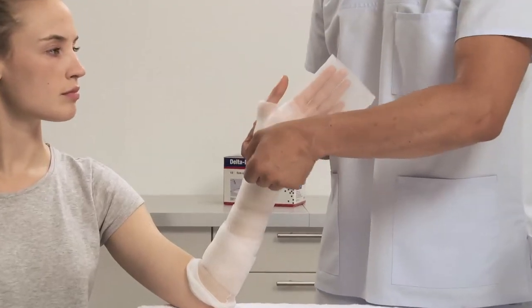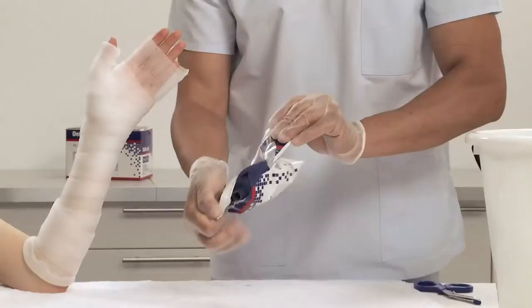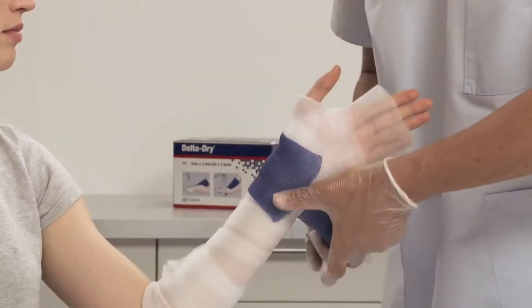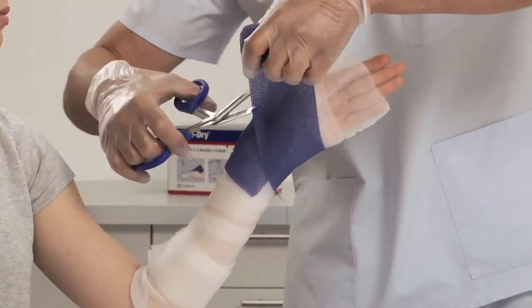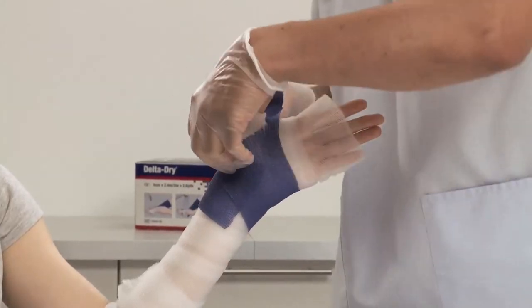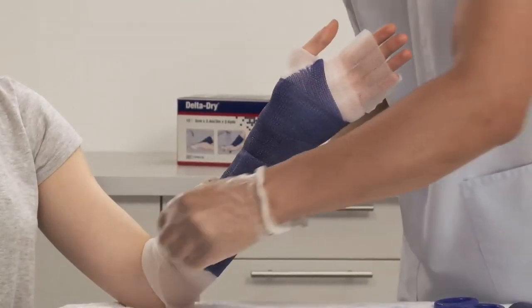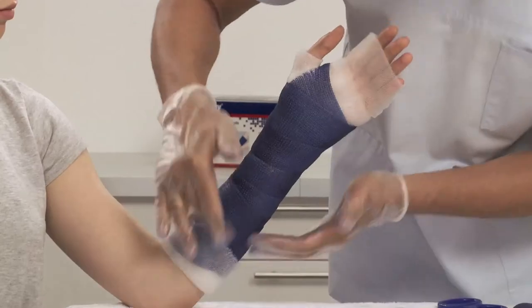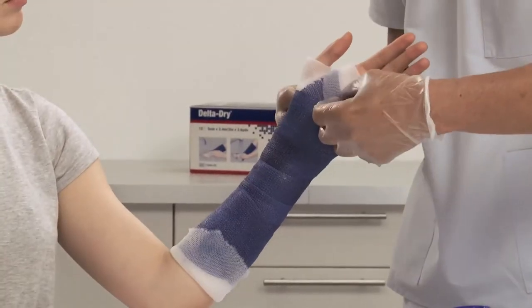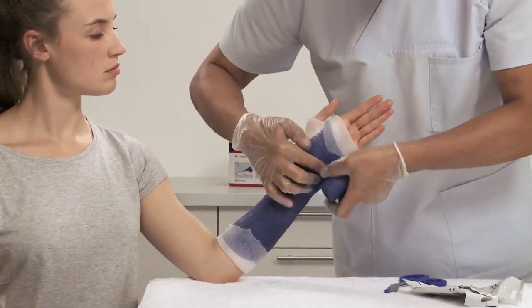Fold back the thumb stockinette to create a soft edge at the thumb area. Put on protective gloves before applying the synthetic cast tape. Choose the appropriate width of cast tape and dip the bandage in water according to cast tape activation instructions. Apply the synthetic cast tape using standard application techniques. Before applying the last layer, fold back Delta Dry Stockinette at the proximal and distal sides for protection of the skin and soft edges, then fix these cuff ends with the last layer of cast tape.